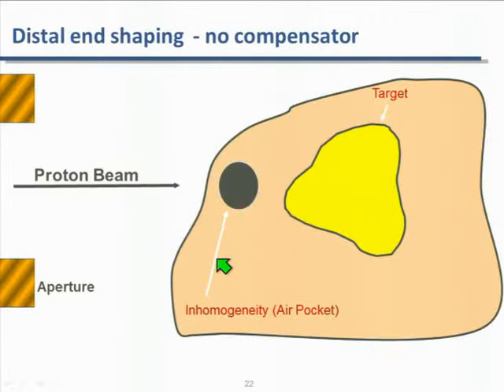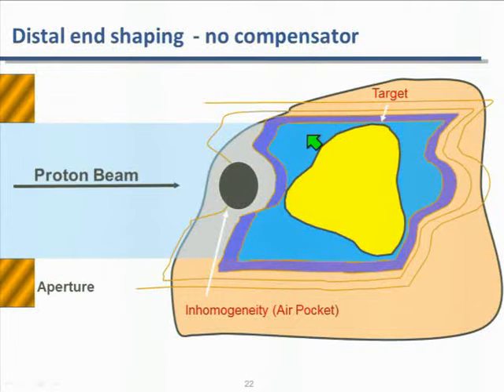To remind you of the purpose of the compensator in proton therapy: if you don't have a compensator, you deliver a beam, and take this region here to be your prescription region, you'll find that you're covering the target fine, but you're over-covering because your beam has gone through an air cavity over here, so it's overranged. So this is undesired dose. Well, the compensator takes care of that.